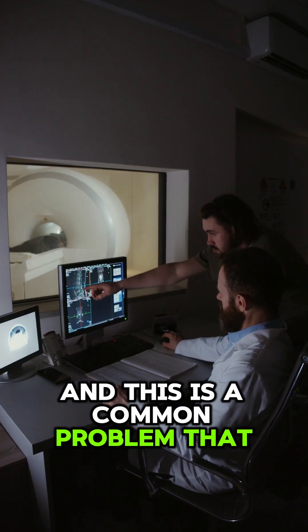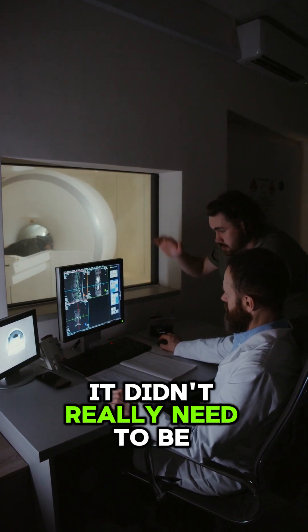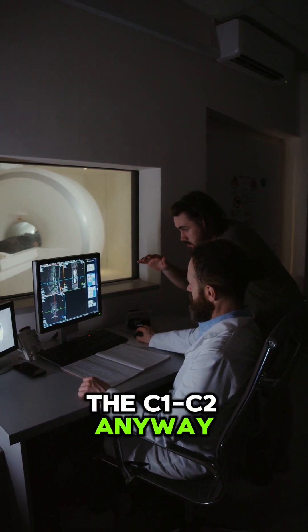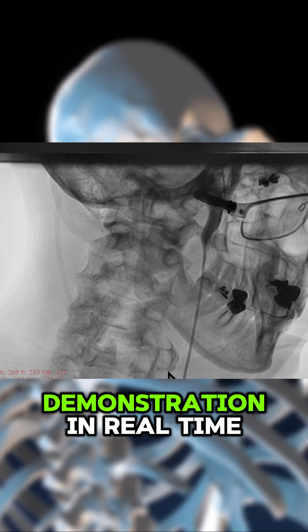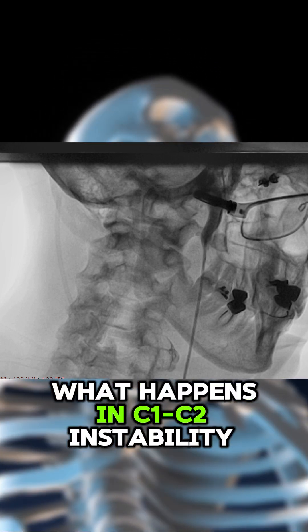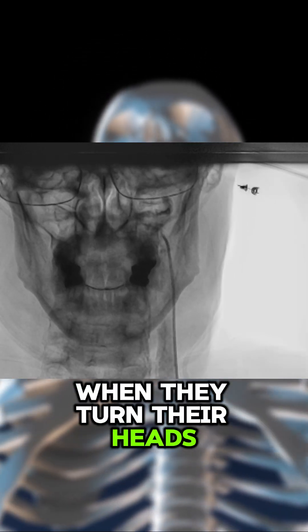This is a common problem that we've seen. It didn't really need to be diagnosed because we were going to stabilize his C1, C2 anyway. But it is a really beautiful demonstration in real time of what happens in C1, C2 instability patients when they turn their heads.